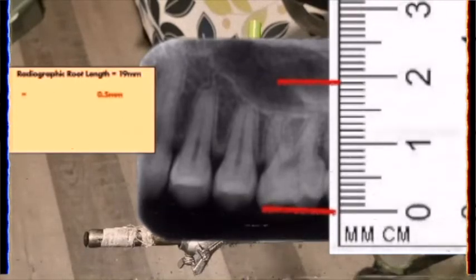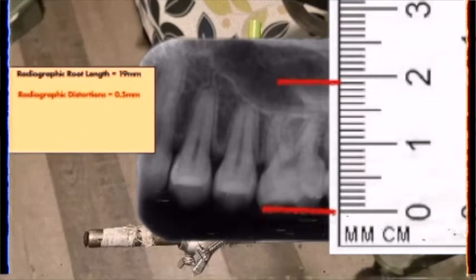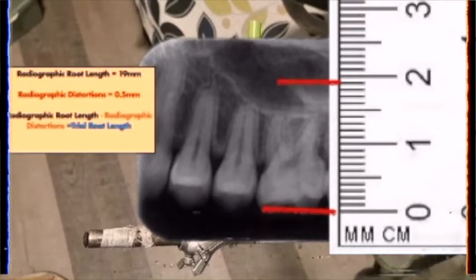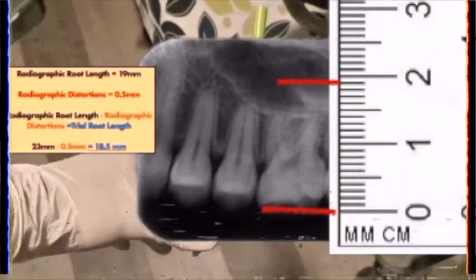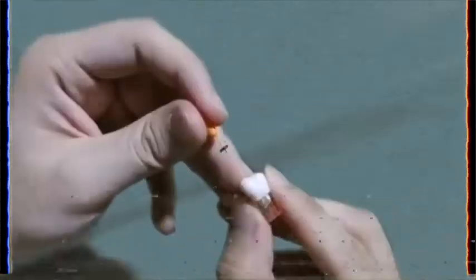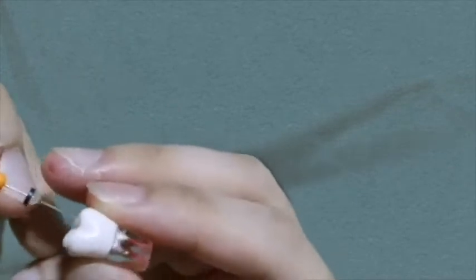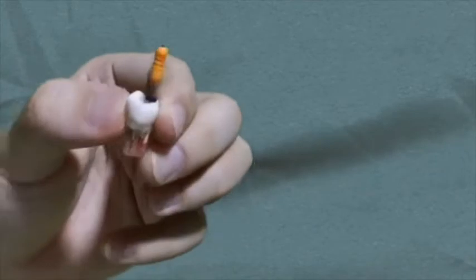So now, with the radiographic distortions, we have to subtract 0.5 millimeters. With the simple subtraction, we will come up with 18.5 millimeters as our trial working length. We will now try to gain apical patency with our trial working length, and during that time we may have to modify the trial working length based on the height of our reference point or the overall length of each root.